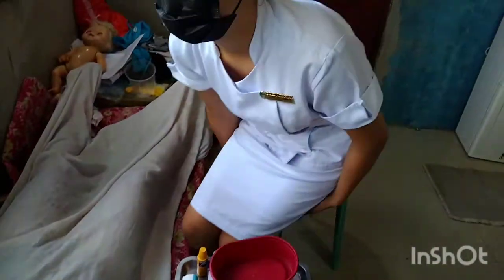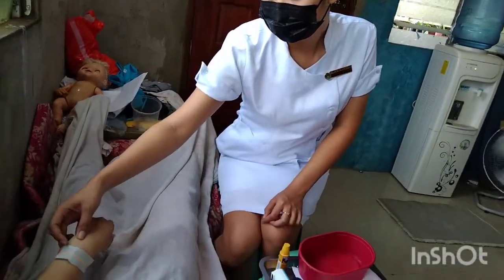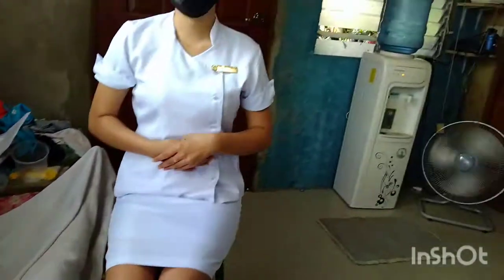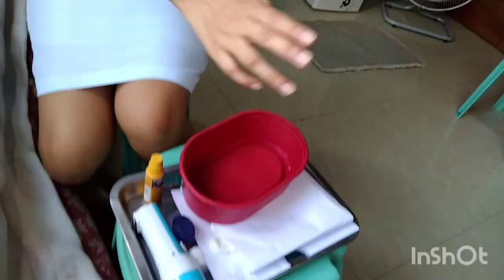Now, proceed in preparation of the patient. Step number 1 is to identify patient and explain the procedure and need for the patient to keep knees positioned during procedure. Describe pressure sensation that will be felt during catheter insertion. Patient will feel reassured if the procedure is explained and if she is handled gently and considerately.